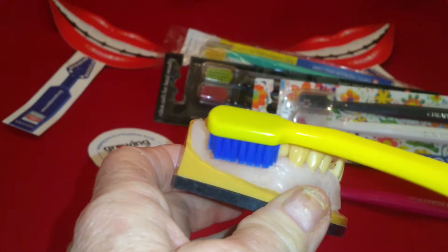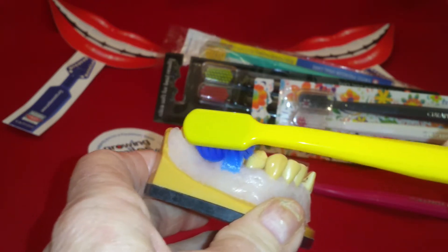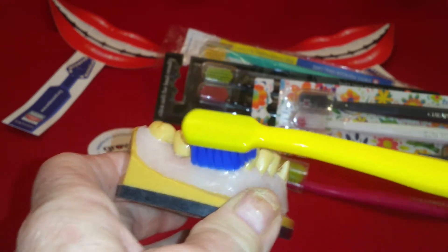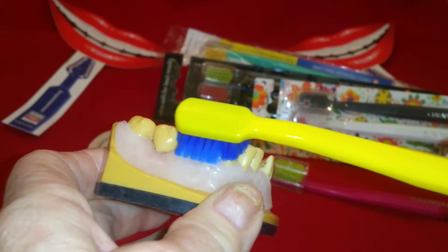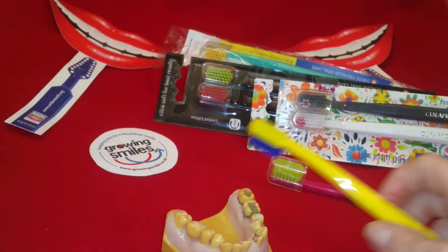What you want to be doing is working the bristles down into this area gently — you're not scrubbing the floor. You want to just vibrate the bristle tips around where the gum and the tooth meet. That's what you want to be doing.